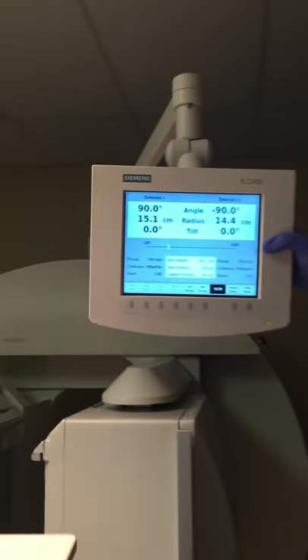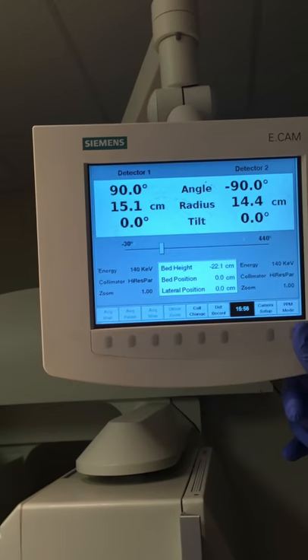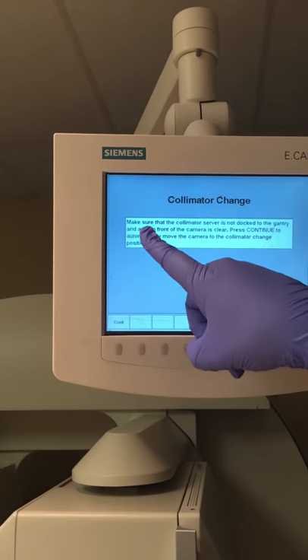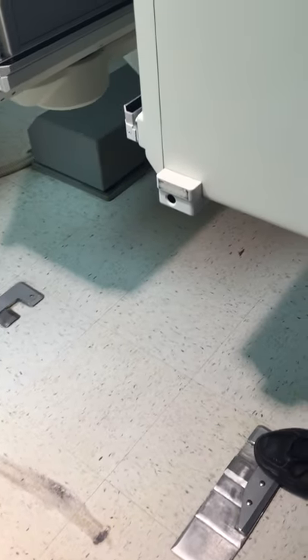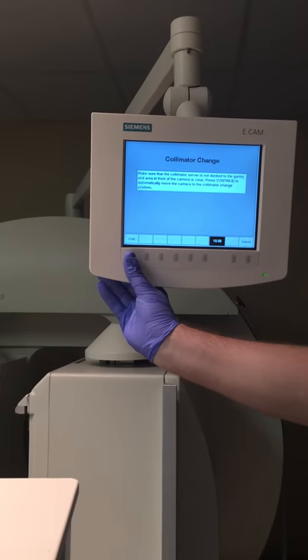If you look at the P-scope right here, you have options and we're just going to click collimator change. It says to make sure the collimator cart is not docked. If we look down here, these metal pieces are where we dock the collimator cart. It is not docked, so we're okay to continue. We'll push continue.